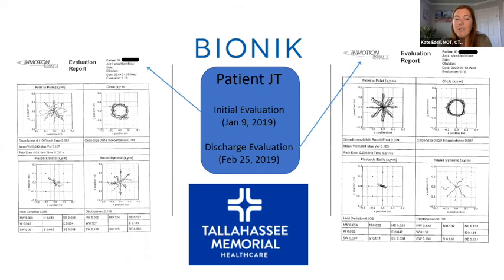Wow. Now, I know you mentioned that all of your patients' therapists are fighting over the device. Can you tell us how you manage that in terms of dosage, or how often your patients are using it? Is it time-based? Is it a number of repetitions? The way we've been doing it at the clinic is 30 minutes.